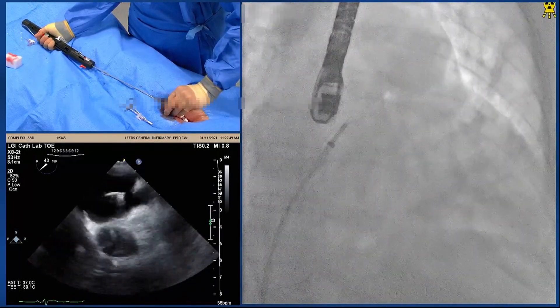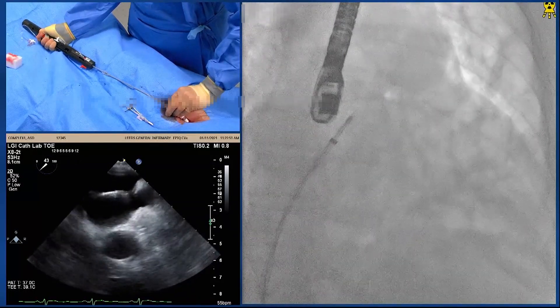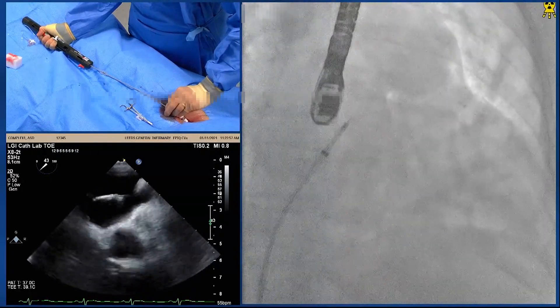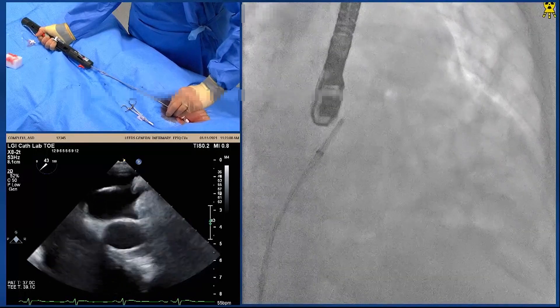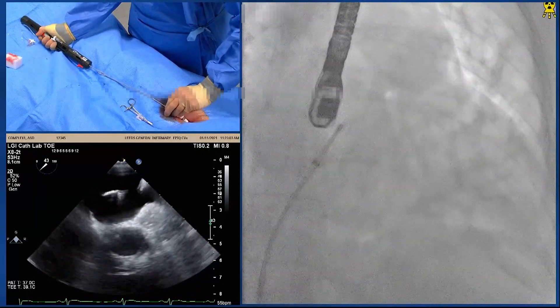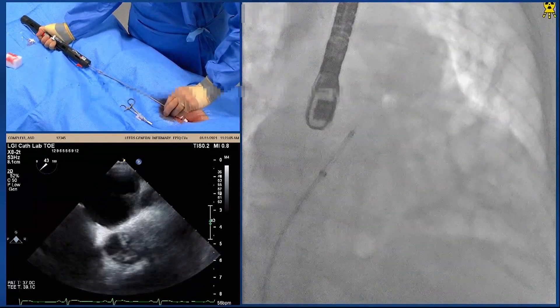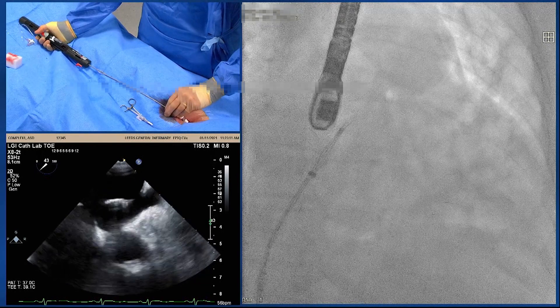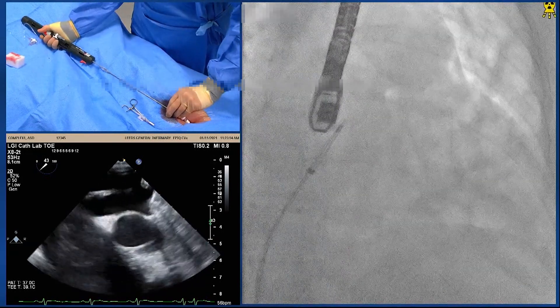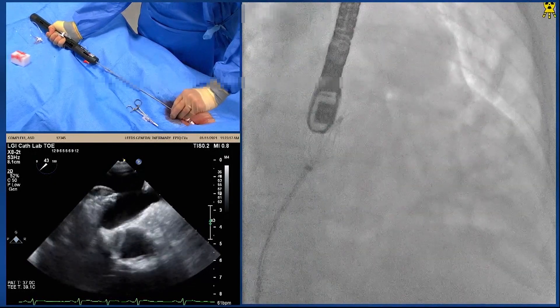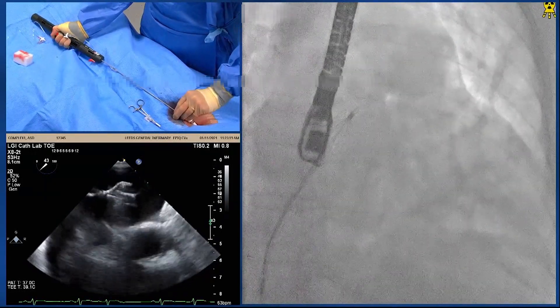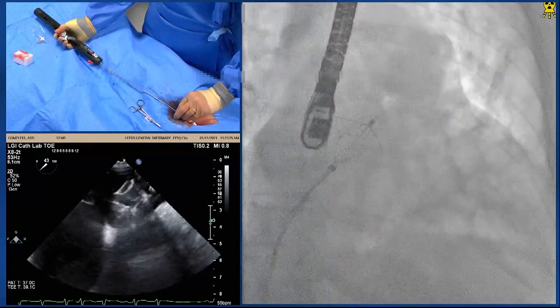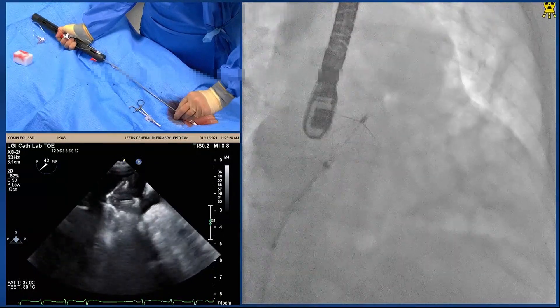Now I can unsheath the device into position. No need to advance any further into the left atrium. Really keeping an eye on the TOE and making sure I don't advance on the fluoro, using the ribs and the spine as markers. I tend to do this quite slowly. I've come to the hard stop now, so we're fully advanced. The left disc will now begin to form. You can see the left disc forming nicely, free of the appendage.